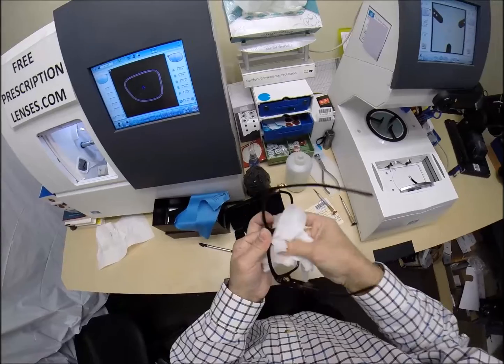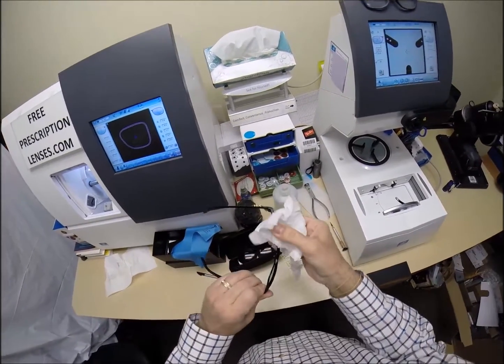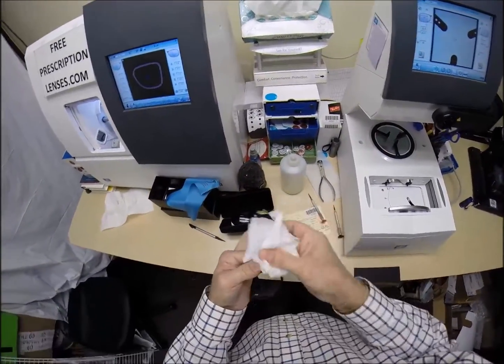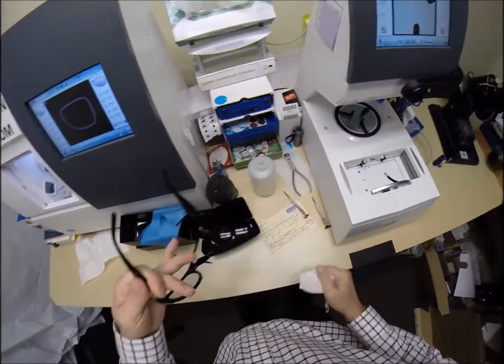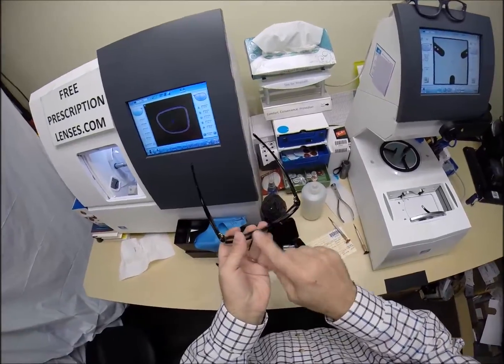But I'm going to get these in standard alignment first. But if these are off kilter at all, just stop by your local place and tell them if they're too loose or too tight. 99% of all optical shops will do free adjustments if you ask them, but I'm going to get these in standard alignment first, also known as a 3-point stance. The 3 points are 1, 2, and the bottom of the frame being 3.